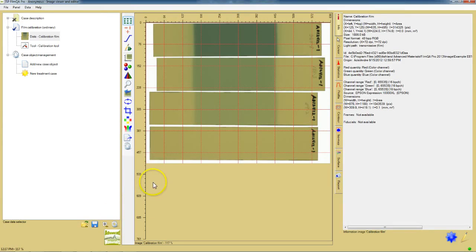To fit all the calibration films in a single scan requires using pieces much smaller than 8 inches by 10 inches. And a good way of doing this is to cut strips 8 inches long and about 1 to 2 inches wide. Not only does this preserve an important clue as to the orientation of the strips to the sheet, but it also means that a set of calibration films can consume less than a single sheet of film, since it only requires 3 or 4 exposures plus an unexposed film.